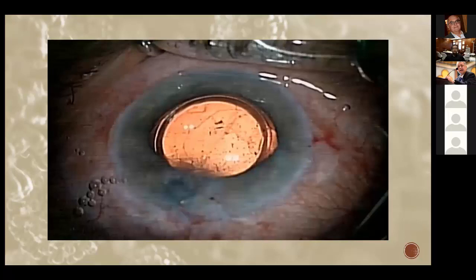Yeah. And as a rule, Dr. Wael chose to be safer from the beginning, but as a rule, the later you can put the capsule tension ring, the better. You can postpone the capsule tension ring until you really have to put it. This facilitates the surgery, but of course, Dr. Wael did an excellent job. The trick he talked about, where he is placing the ring, was very helpful during the surgery. So excellent job, Dr. Wael.